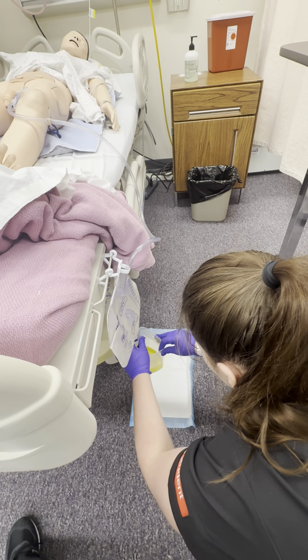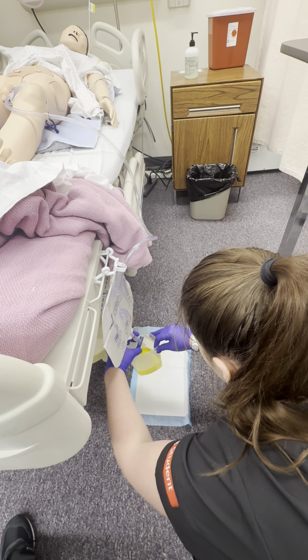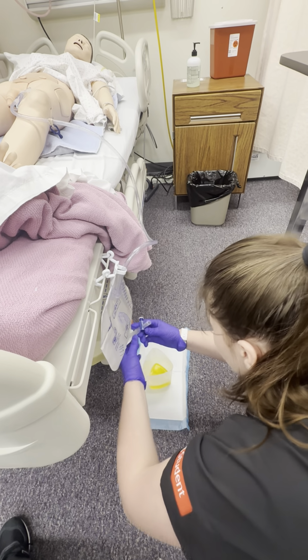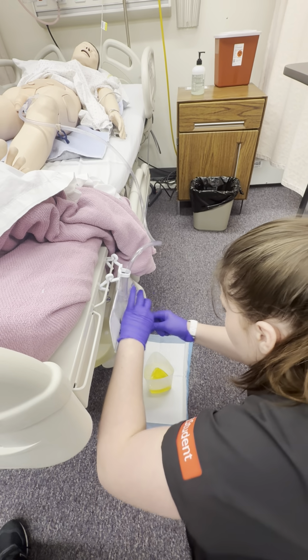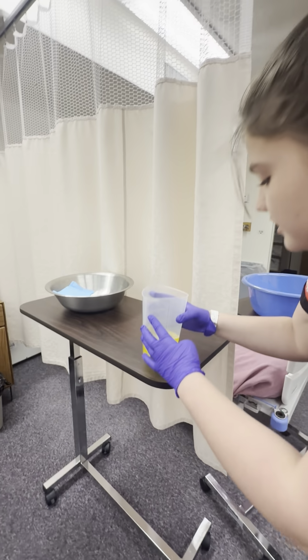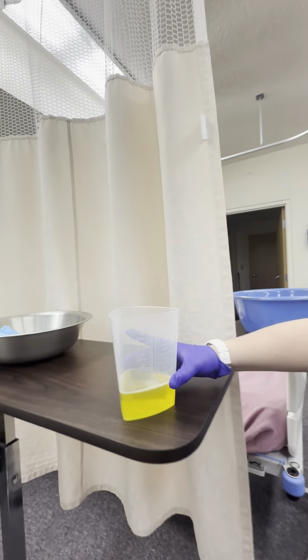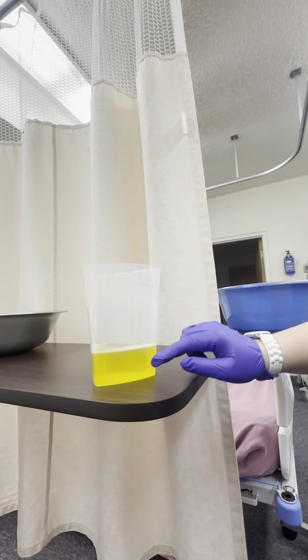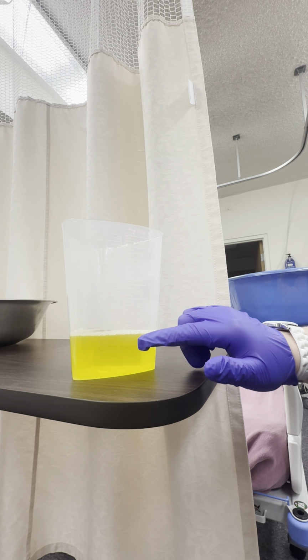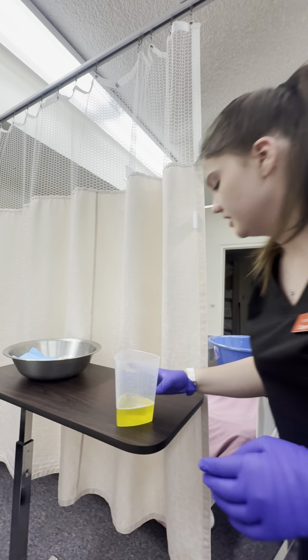Okay, make sure that that is fully drained. Okay, I'm gonna reclamp this cath bag, and then we will put it right back, so we're gonna dispose of it here in just a minute. I'm just gonna go ahead and set this on a flat surface and note the output. Looks like we're at just about 250 mils, so we'll go ahead and document that, maybe just below, somewhere between 225 and 250. There in the middle, looks like that line is a little hard to distinguish.